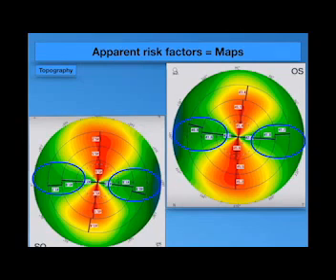especially if there's no pathology in the cornea explaining that. You may have a point with very steep K, but it will be explained clinically on the slit lamp by a scar in this cornea. So if you can explain this point, you may go further in studying the other parts, okay? But if you don't have any corneal scars or corneal thinning in this cornea, you will consider this abnormal steepening in this part of the cornea, especially if you have this steepening in the inferior part of the cornea.